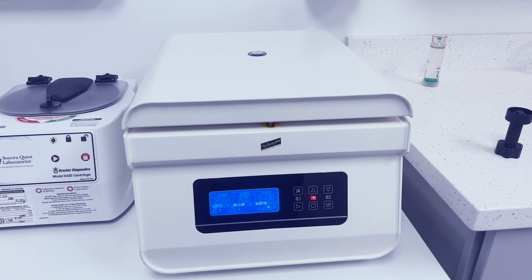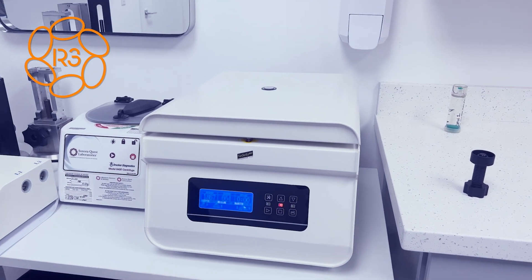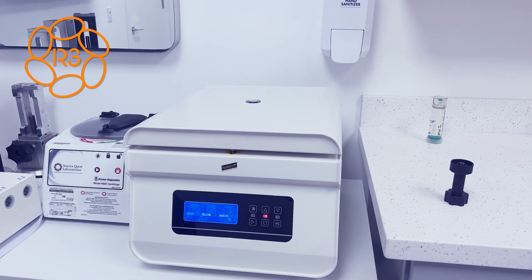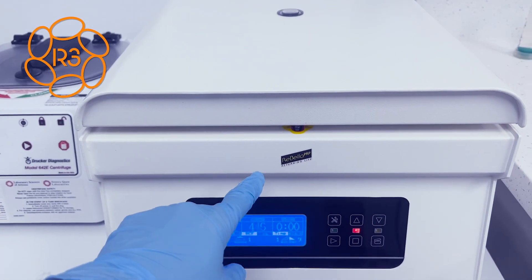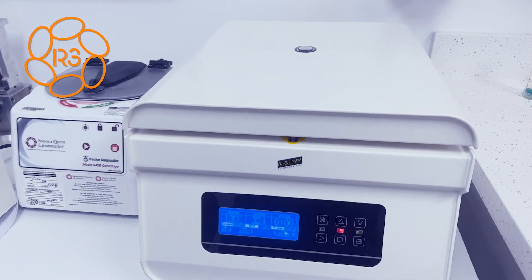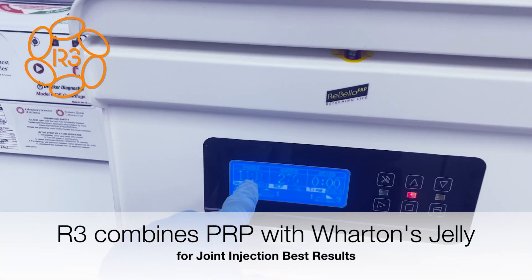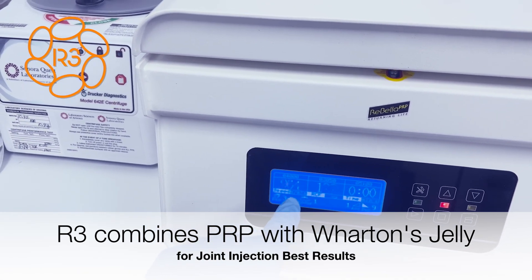She took 30 cc's of his blood and we put them in our kits — the ReBella PRP kits — and this is the ReBella centrifuge. This is spinning right now; actually the spinning is done, it's just slowing down, and then this will automatically pop open as soon as the rotors stop.